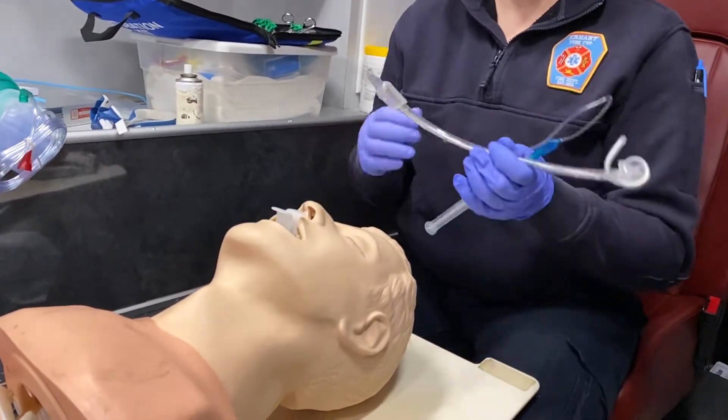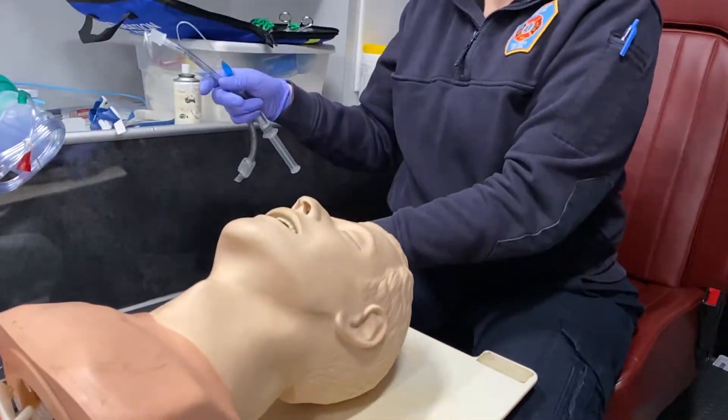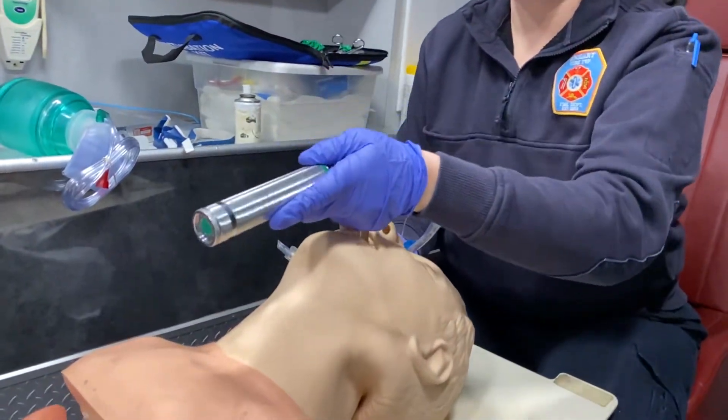They've been pre-oxygenating your patient the whole time, so you can go ahead and remove the OPA. You want to tilt their head back and you're going to insert the laryngoscope.